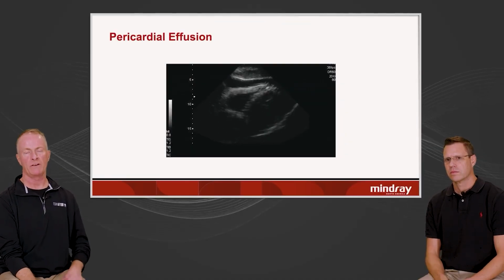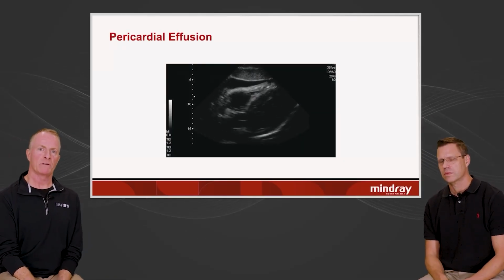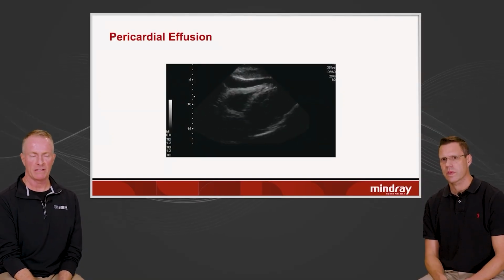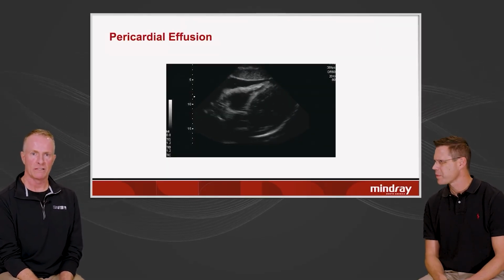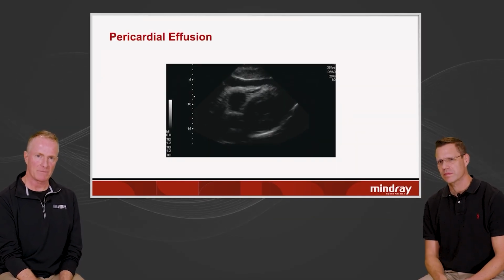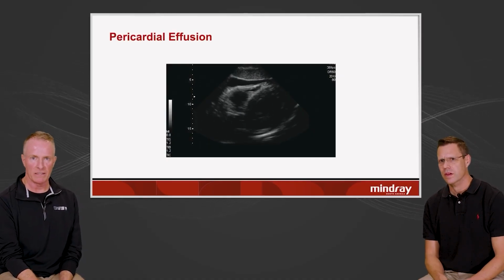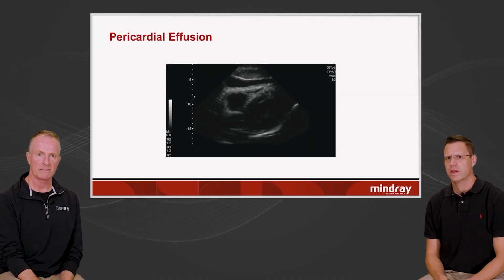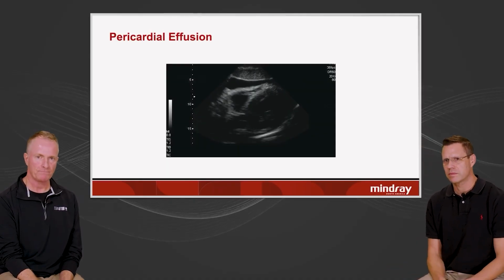Okay, let's talk about pericardial effusion. The number one symptom of pericardial effusion is dyspnea. People think of shock and Beck's triad, which doesn't really exist most of the time. But dyspnea is by far the most common symptom, and pericardial effusion is easy to see. Then it's a matter of, is it tamponade or not, and you can work through that, but the first thing is to recognize it. That fluid, again, makes the cardiac window easier to image, just by having it there.